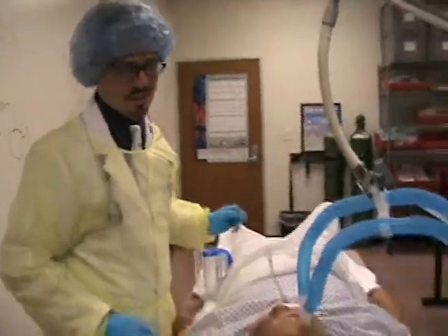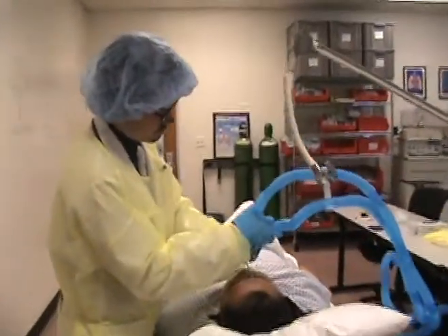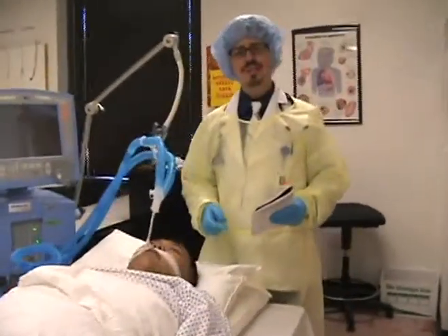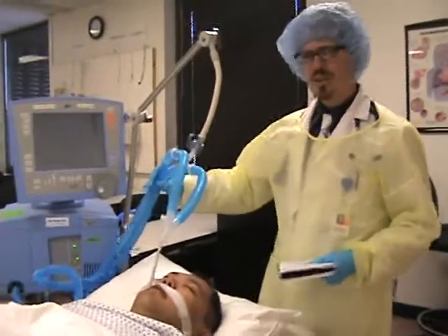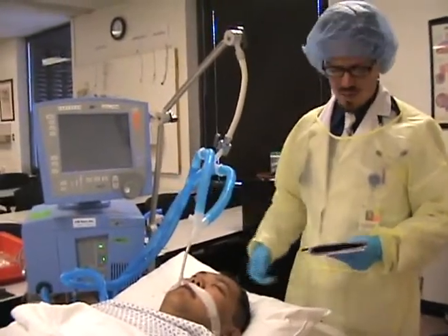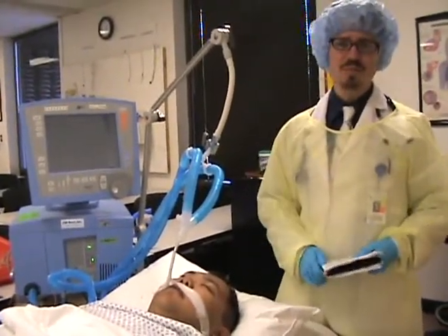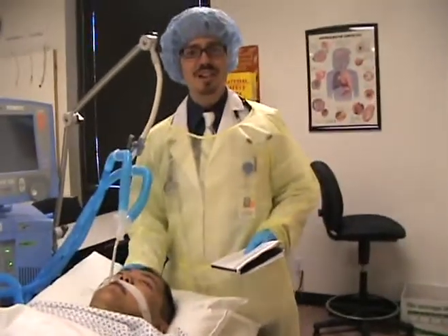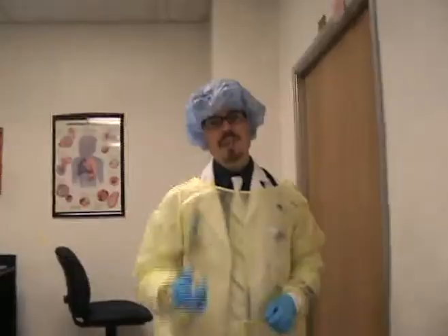We're going to continue on in step twelve, in which we're going to reassess the patient. We're going to want to make sure that our line is secure and tight, as well as make sure that our patient is comfortable. Our line looks fine, and our patient is both paralyzed and sedated, so you don't have to worry about him being uncomfortable.